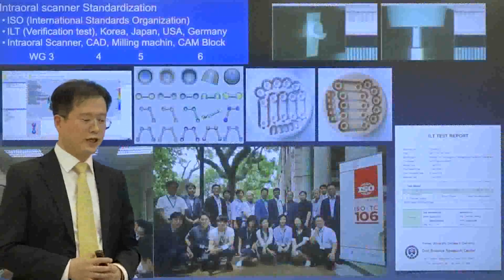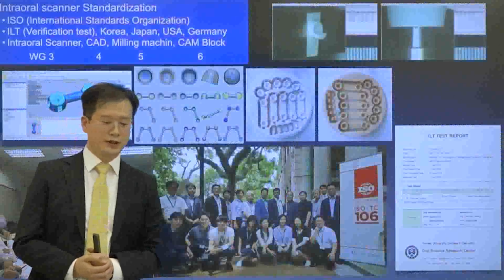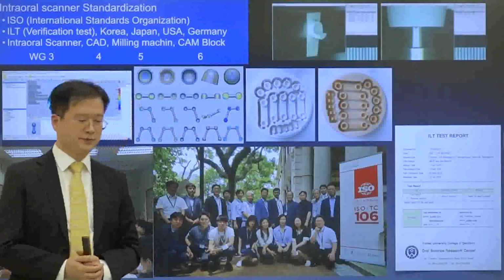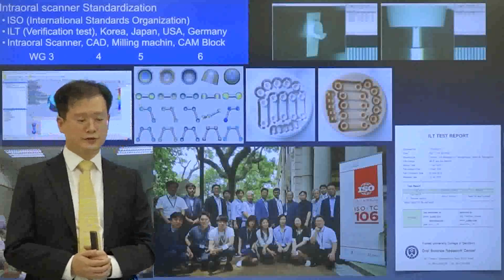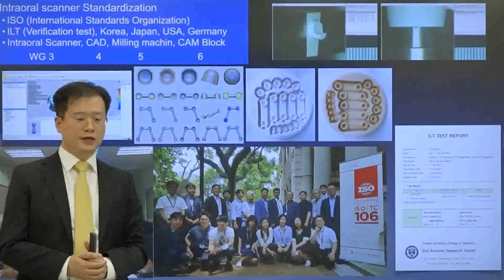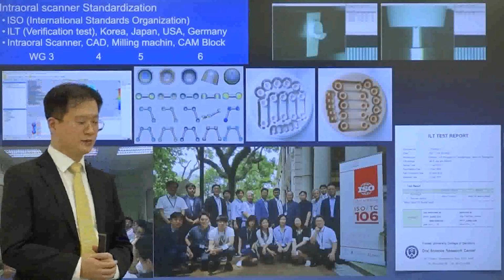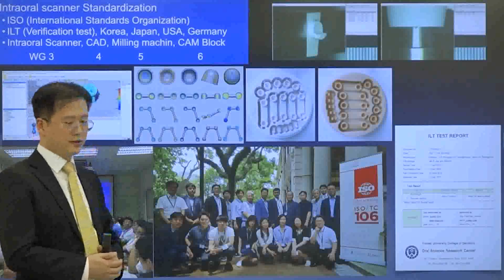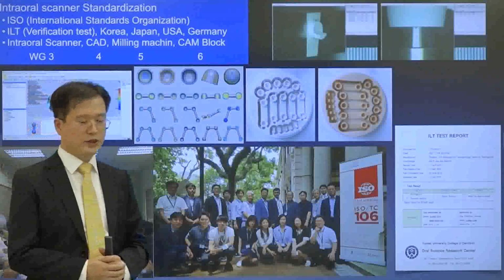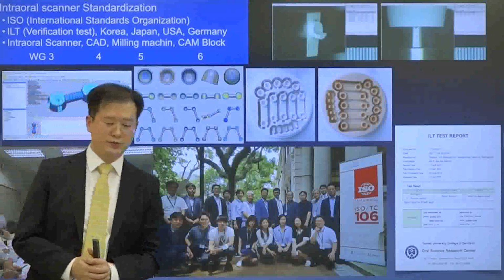In this regard, I'm working as a Korean expert in the Digital Dentistry Division of the International Organization for Standardization, ISO. Here I'm evaluating the validity of the standards that are being developed. I conduct international experiments such as milling machine accuracy, and give an opinion on the shape of the implant scan body.